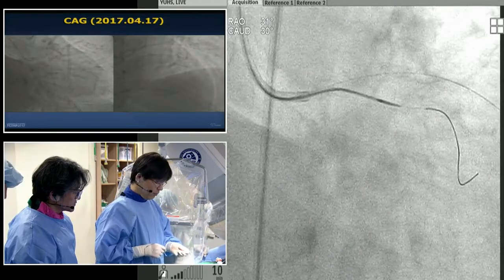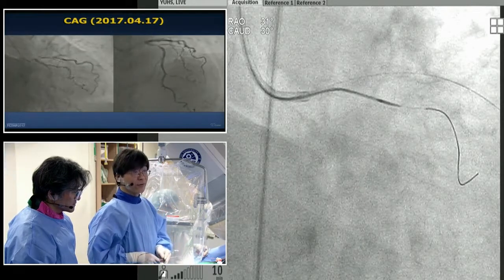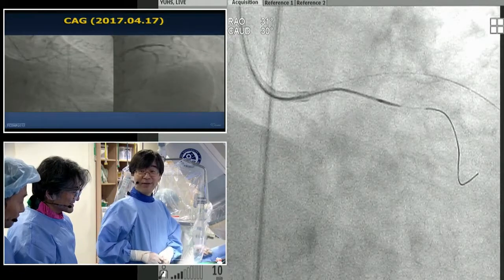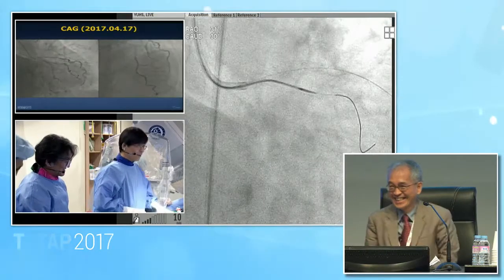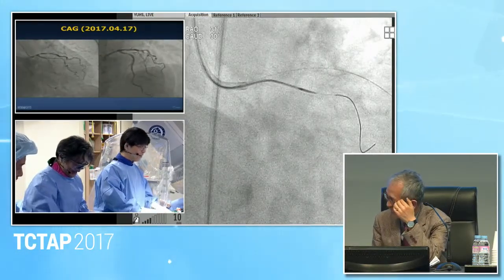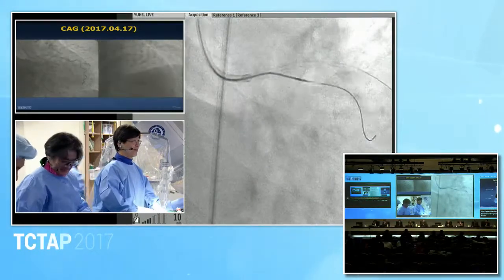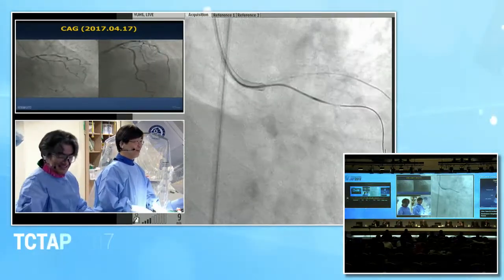So, Doctor, will you finish without a final angiogram? Of course. I already declared that. We will not use contrast for this patient. You never expect that, but we will ask you for at least 2 projections. And be sure to have recorded at least the IVUS.